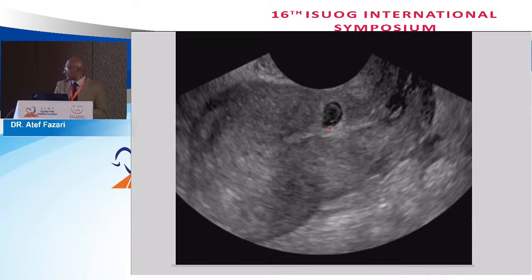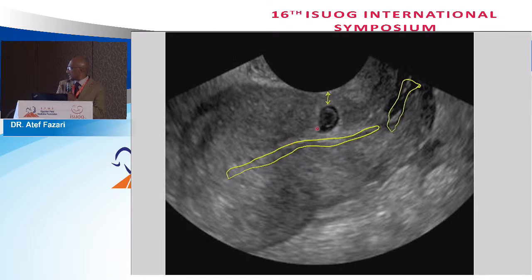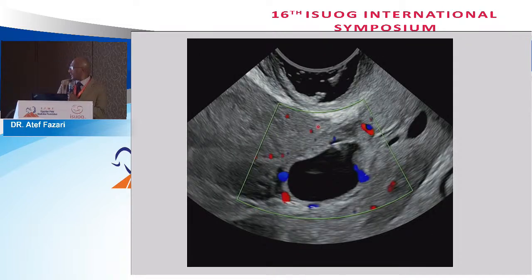Here clearly demonstrated is the myometrium line, a very small myometrium, the sac high above, anterior to the endometrial cavity, which is empty, with a closed, empty cervix. This is most probably an ectopic scar pregnancy. Vascularity around that is always suspicious of ectopic scar pregnancy.